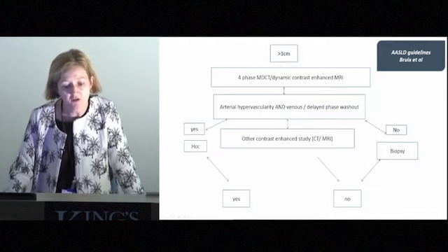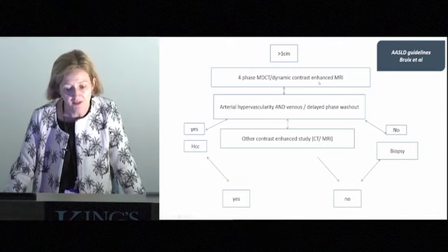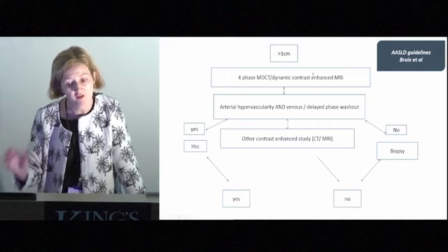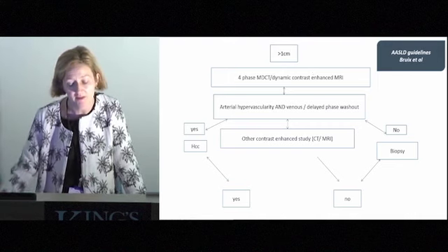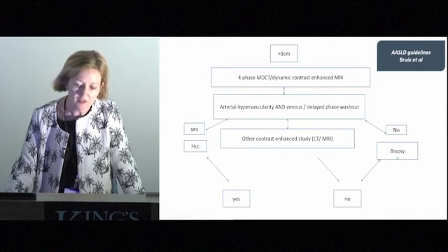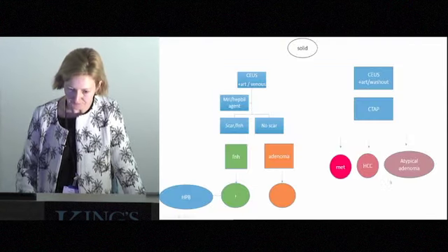Greater than a centimetre, you need your 4-phase with delayed contrast imaging, whether that's CT or MRI. The Americans at the moment don't recommend using contrast ultrasound because of the overlap between hepatocellular adenomas and HCCs. If there's any question, then they ultimately go to biopsy.